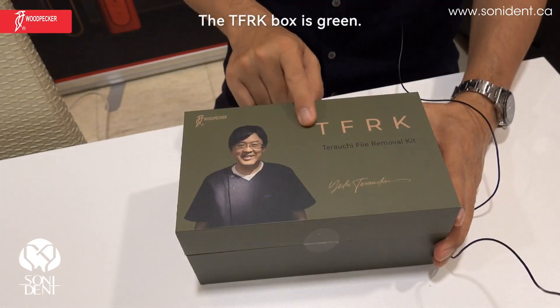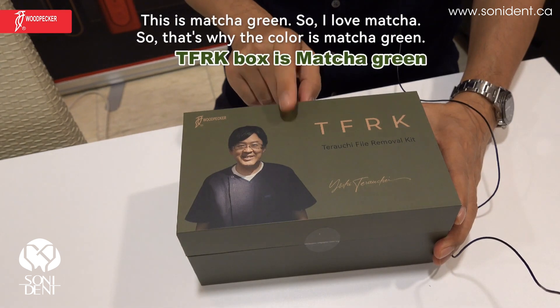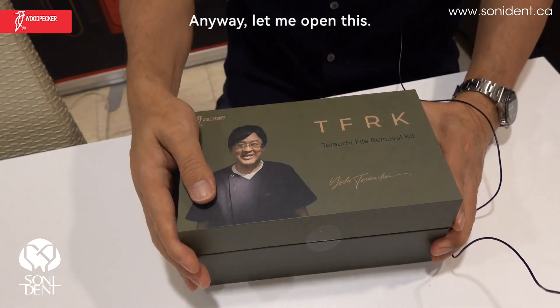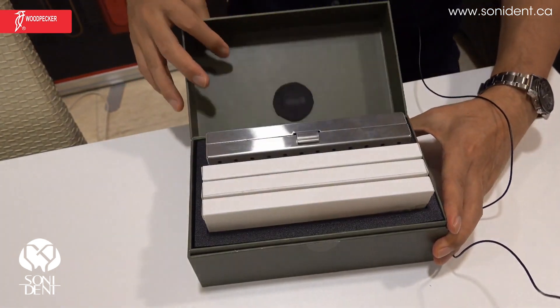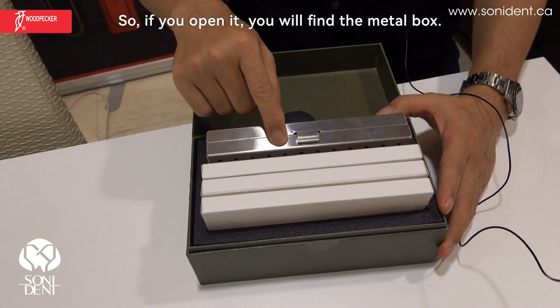Let me open the box. The TFRK box is green — this is matcha green. I love matcha, so that's why the color is matcha green. Let me open this. If you open it, you will find the metal box.